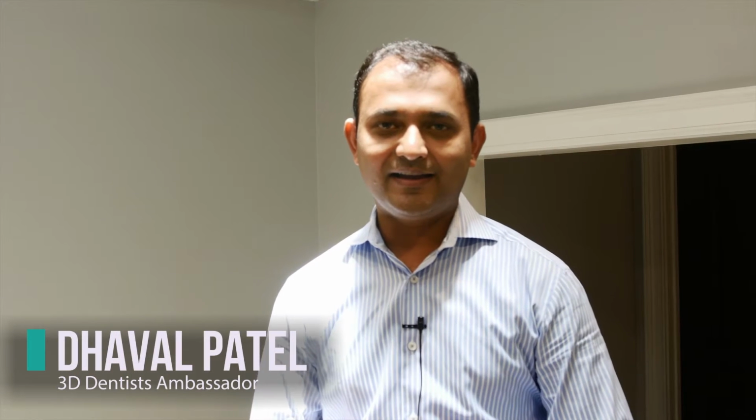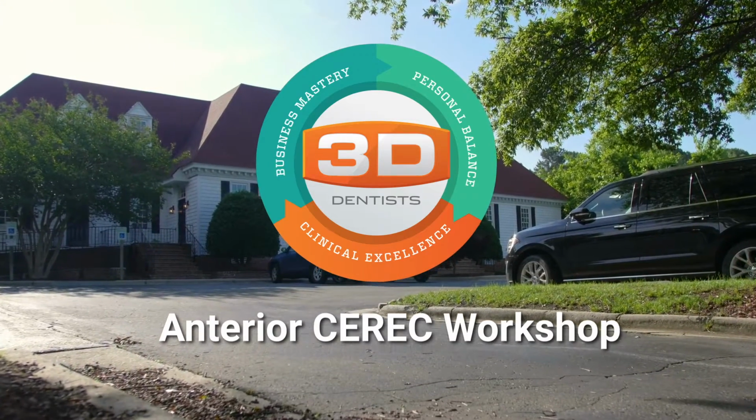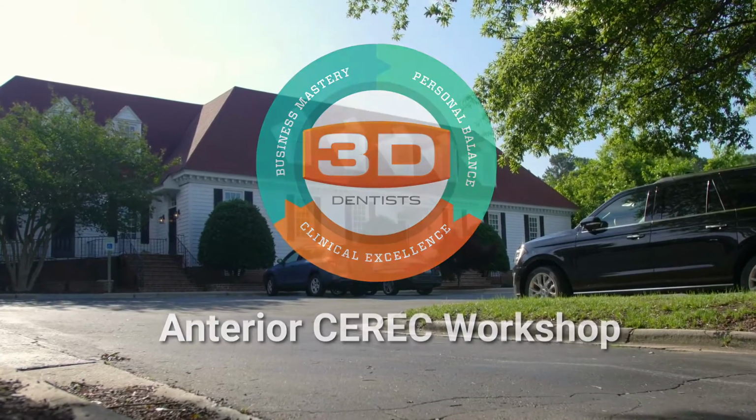Here we are today at the 3D Dentist Center with Dr. Taylor Agarwal in Raleigh, North Carolina. And I'm teaching an anterior CEREC course. It's a 2-day hands-on course.